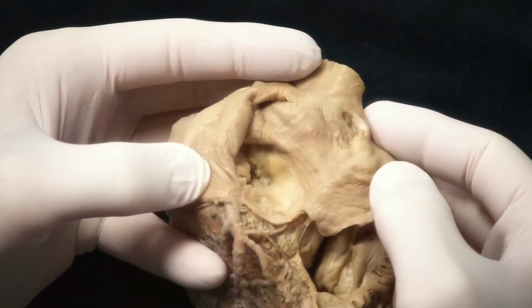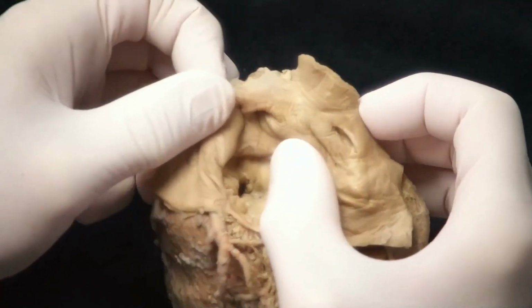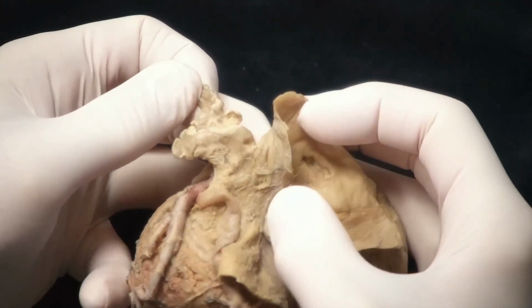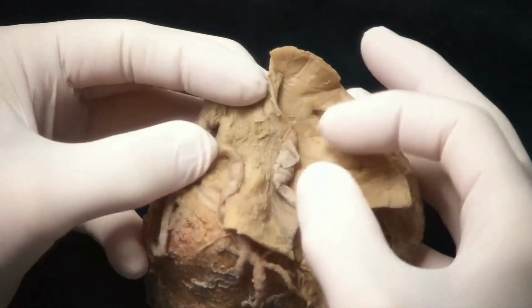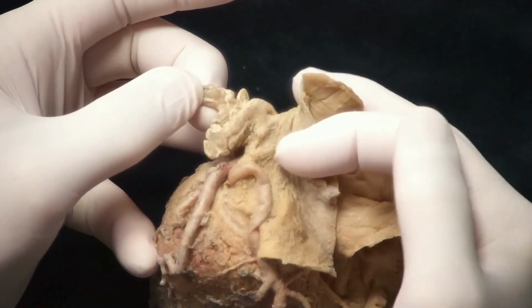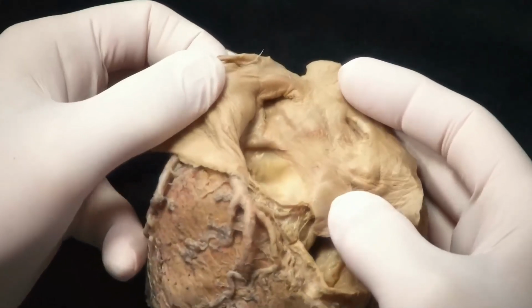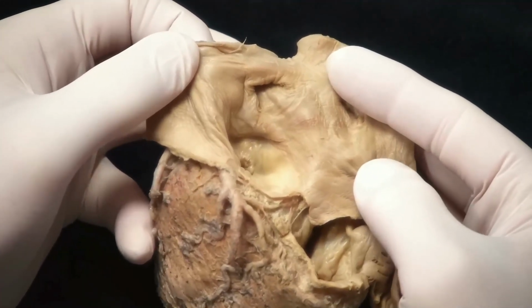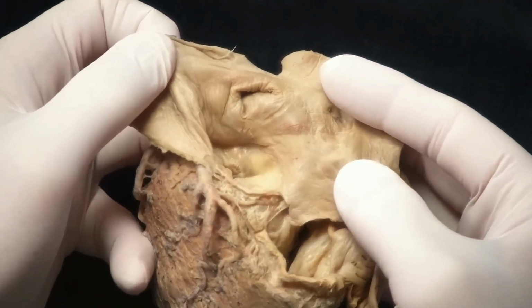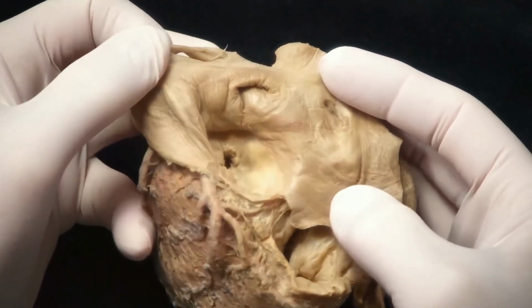Then, of course, to do the concomitant left atrial appendage occlusion, you'd have to be torquing the sheath in a different direction. So the left atrial appendage, the os is up here, and generally the left atrial appendage sits between the left upper pulmonary vein and the lower one, which you can see just below there. Although it is variable in terms of its height, this one is in between the two, which is quite typical. So to reach that, you'd have to torque in a different direction. So I would say it's feasible. It would be feasible to perform concomitant closure of the left atrial appendage with TEER, but that would have to be assessed carefully in each case to make sure that the location of the left atrial appendage is not too anomalous.